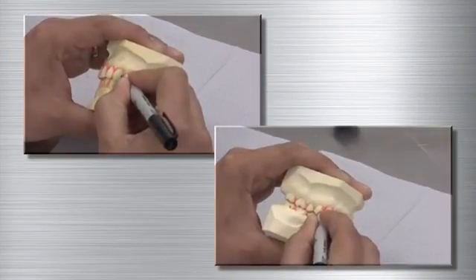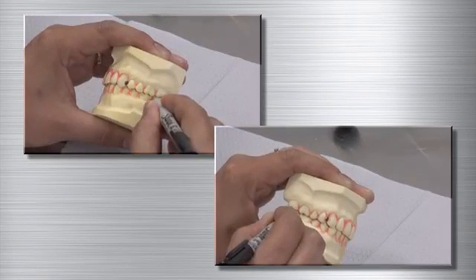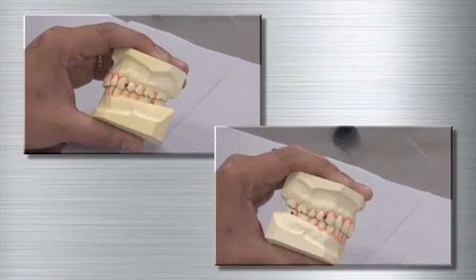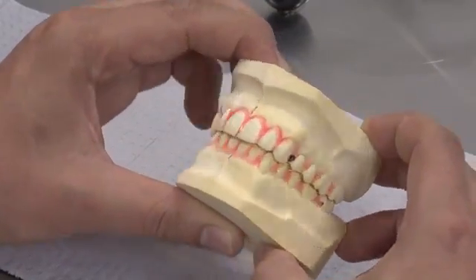Using a black Sharpie, redraw the markings on the model. This will make it easier to see through the thermoformed material. Evaluate all your marks.